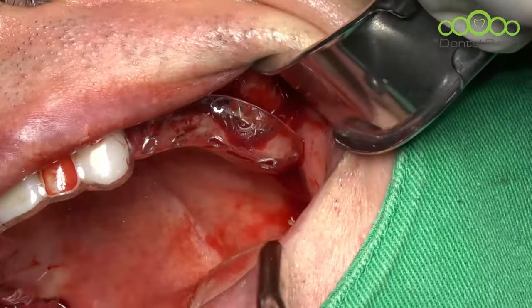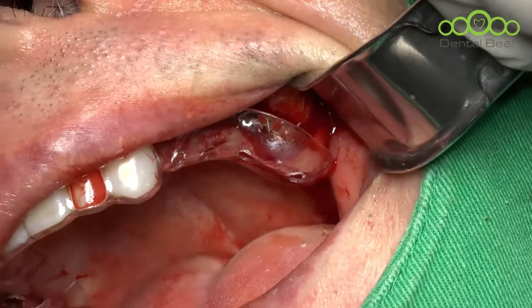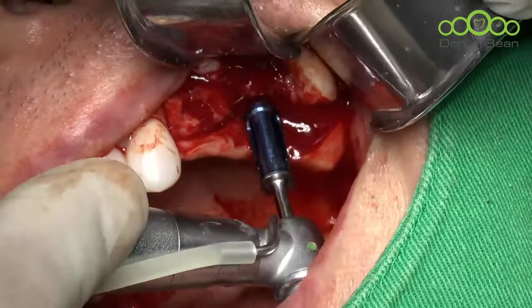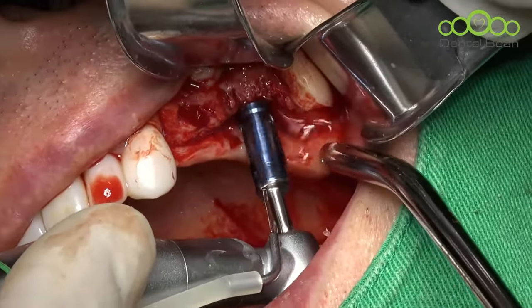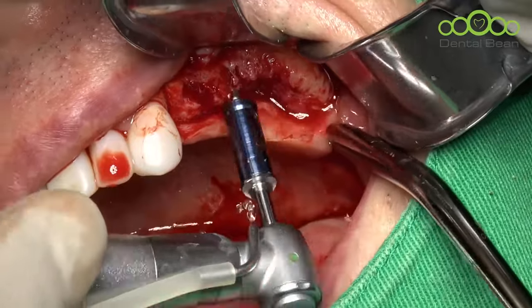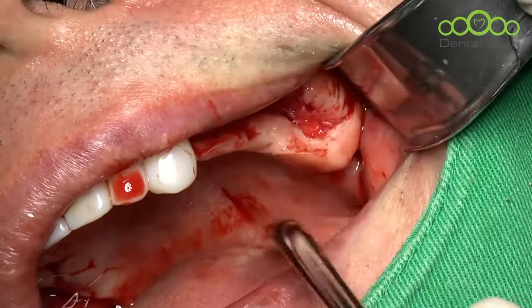Bone height was very poor. 2 mm, 3 mm. Okay, I'll use a 3 mm stopper at that site. Where is it? This one. Remove, please. Difficult to check the real position. Maybe here. Oh, very poor bone. Check depth gauge. 4 mm stopper.